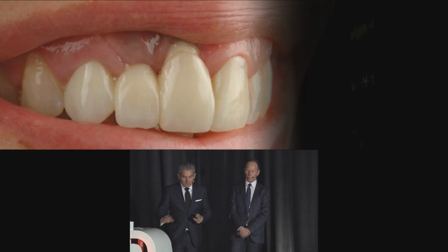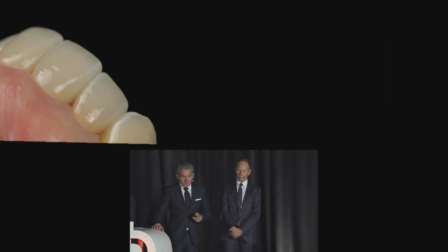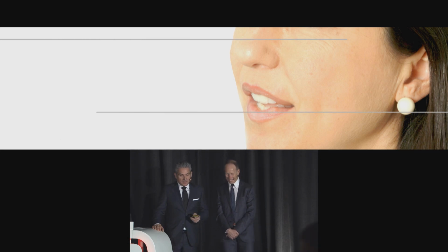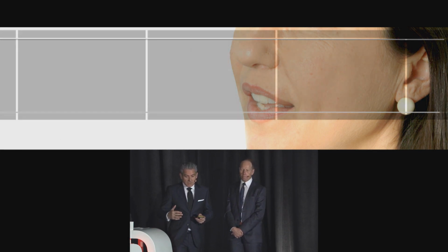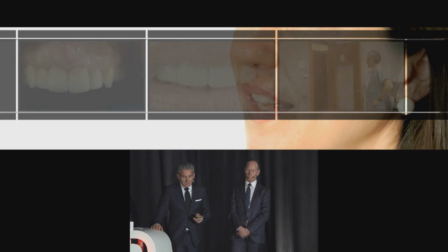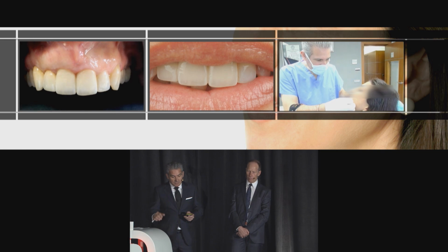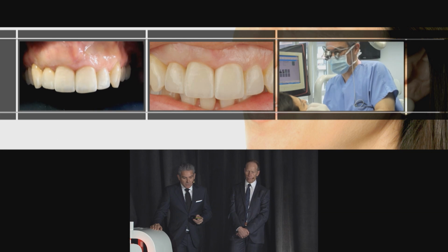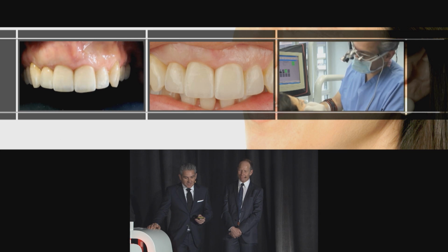Just a short video, a couple of seconds. It is done with an iPhone 4S, where you see on the left side the situation intraorally. The tissue is growing constantly. This is what we see, especially if you select the 1 year picture. You can also see the central incisor grew a little. You know, the iPhone is limited, but at least you can see what is in there.